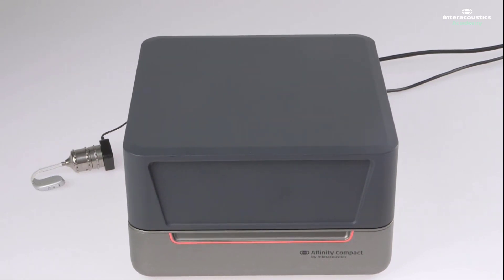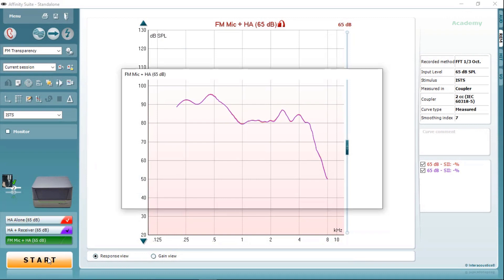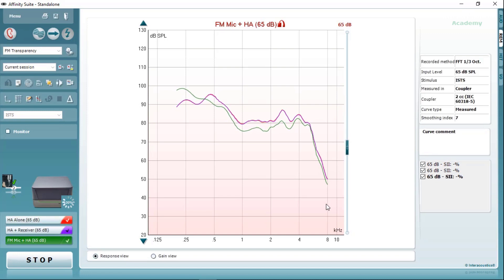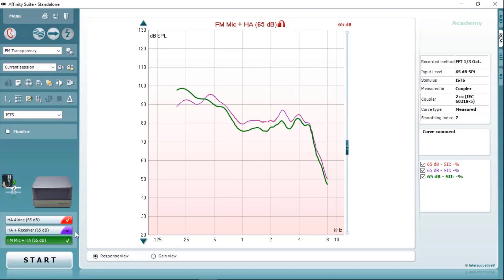Inside, we select the third step in the protocol — FM mic plus hearing aid — and push start. This time a response curve colored in green will appear on screen, and again we are looking for it to mimic the response of the hearing aid in order for it to be acoustically transparent. We can see that after 12 seconds of ISTS signal that this isn't the case, and therefore you need to go into the hearing aid fitting program or the FM program and adjust this in order to improve the response of the FM system.